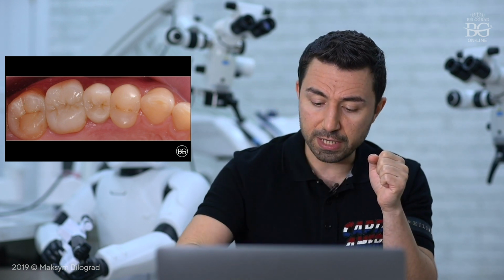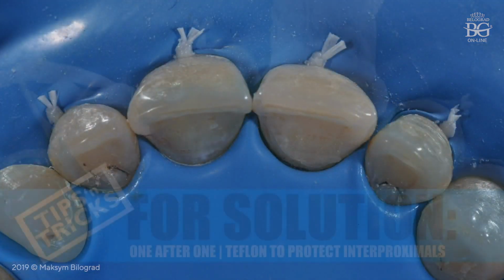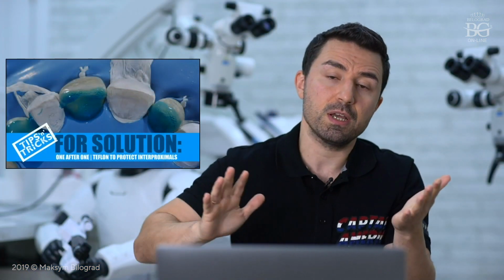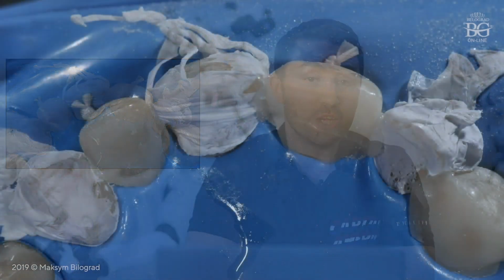Okay, let me show you something from frontal area. I just removed old composite from frontal teeth. I also removed secondary caries, and this is the way we restored palatal areas, palatal sides. We did it one after one, as I mentioned. Adjacent teeth were closed with Teflon, then we made sandblasting, then we do etching, then we do bonding, then we place composite, make adaptation, press, light cure, and then you will have a lot of fun taking this composite from interdental embrasures and interdental spaces.